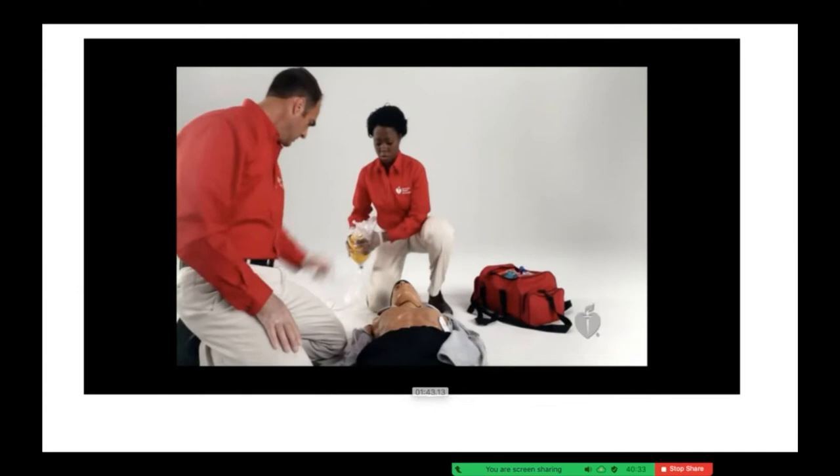Be sure that no one is touching the victim, not even the person in charge of giving breaths. Ideally, you will pause CPR during or immediately after a set of compressions.